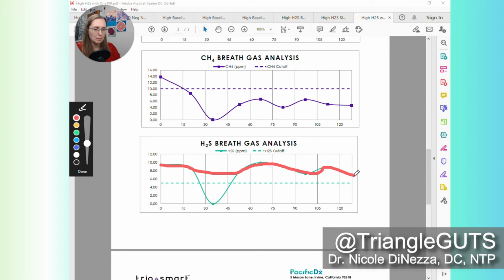And that's probably the line that we're really looking at. We have to take into account that anything below there is questionable because we don't have that third data point. So you need to just omit that from your brain and follow this line and go, all right, we start off high, maybe we get a little bit of a bump. So let's look at the difference between sample number 4 and sample number 5 and see what the difference is there.